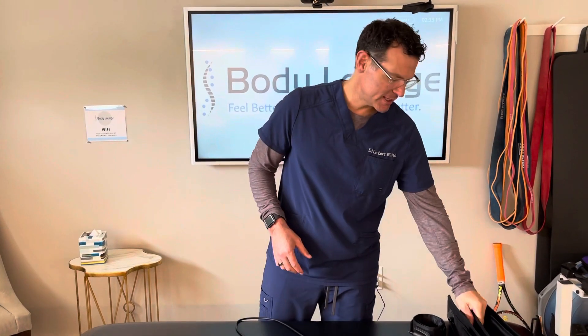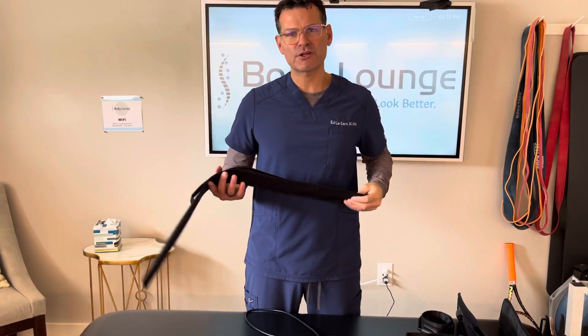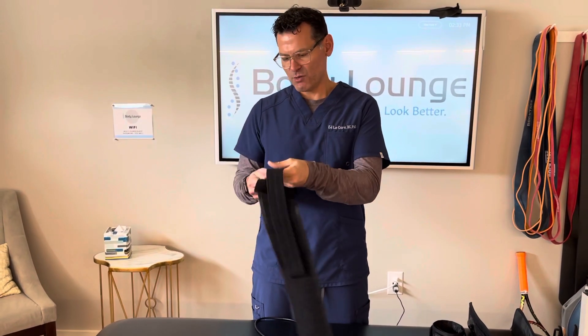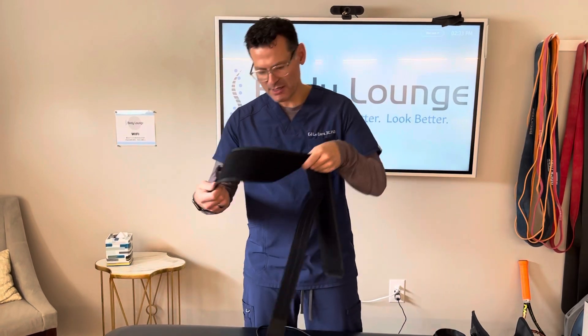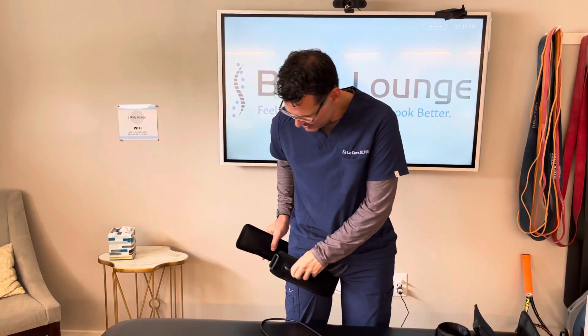In this video, I'm going to show you how to utilize the Gen 3 Smart Cuff consumer version pump and Doppler for the lower extremity. I'm going to find the appropriate cuff — in my case, it's the large cuff because my thigh is a little bit larger than 23 and a half inches. I'm going to take my cuff and make sure that the stem is facing outwards or towards you. I'm going to bring it up as high as I can up into the groin.